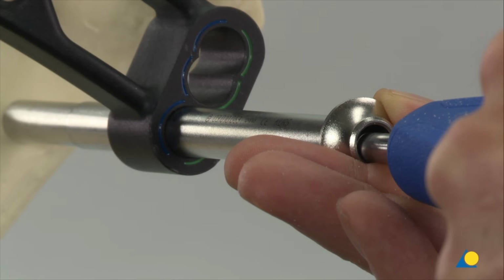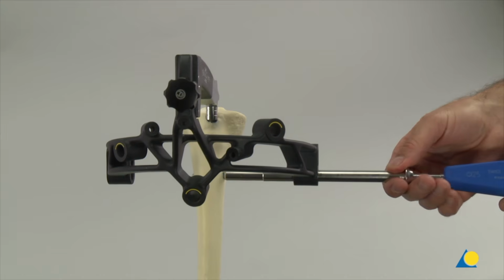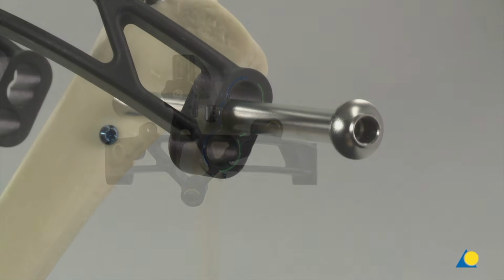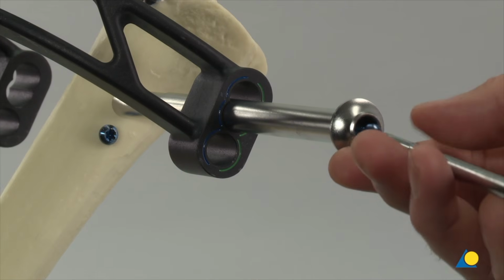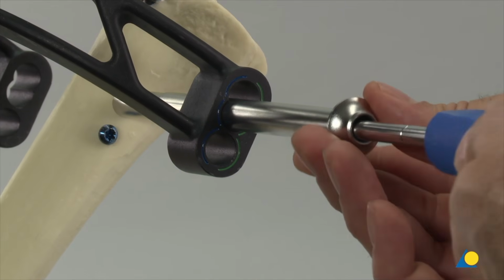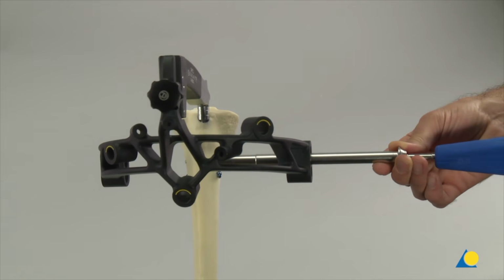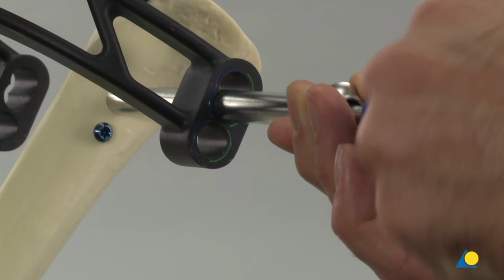The screw length is verified under image intensification. The tip of the locking screw should not project more than 1 to 2 mm beyond the far cortex. After the length of the screw has been verified, the screwdriver and protection sleeve are removed. The screw insertion sequence is repeated for the second mediolateral locking screw using the hole marked STAT2 in the aiming arm. In this case, a 40 mm screw is used.